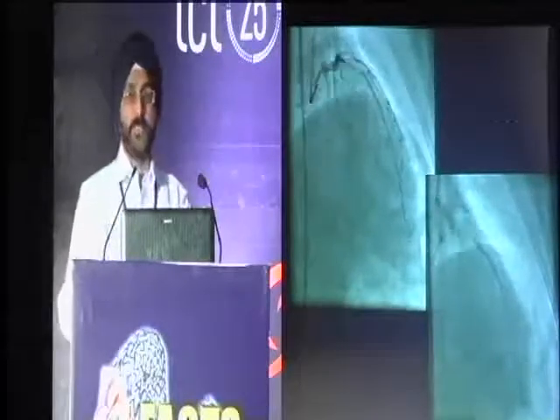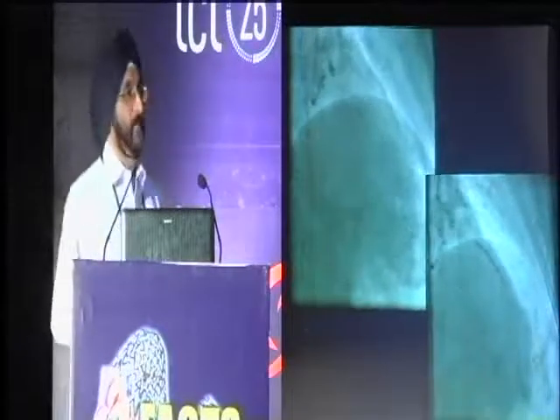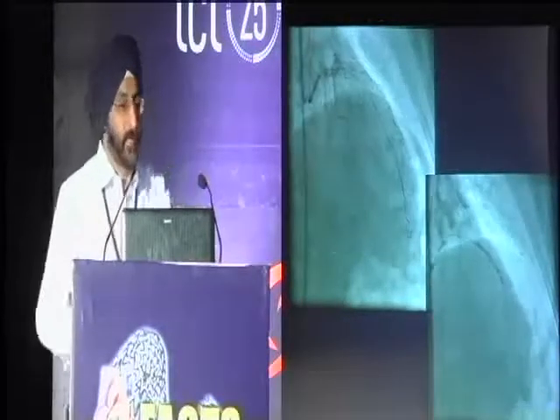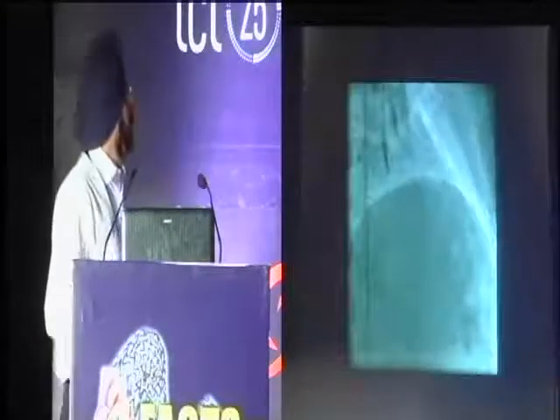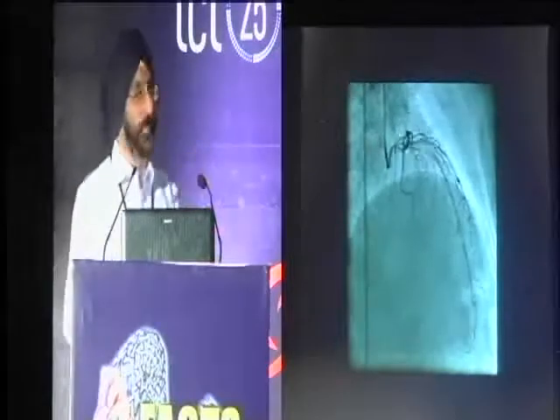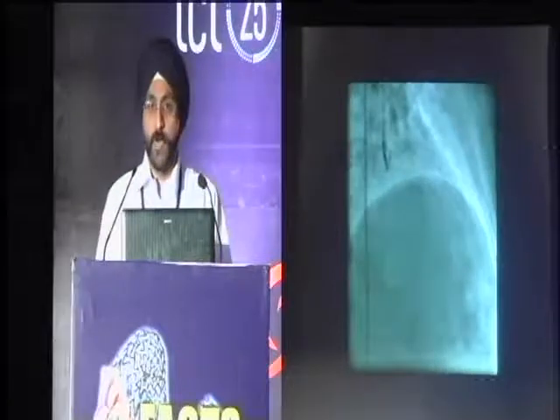Again, a small perforation. This perforation was perhaps at the point which was not giving way, and this led on to the patient complaining of chest pain at that time. Hemodynamically he remained stable. So we immediately inflated the balloon proximal to that, and this was the final result. The active ooze was not there. Definitely there was a crater which had been created because of this perforation.